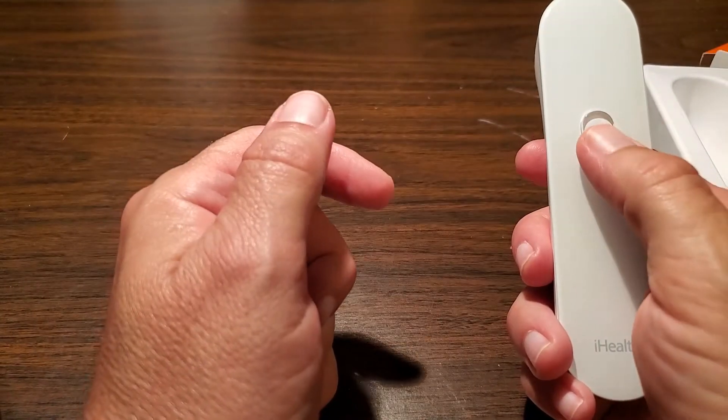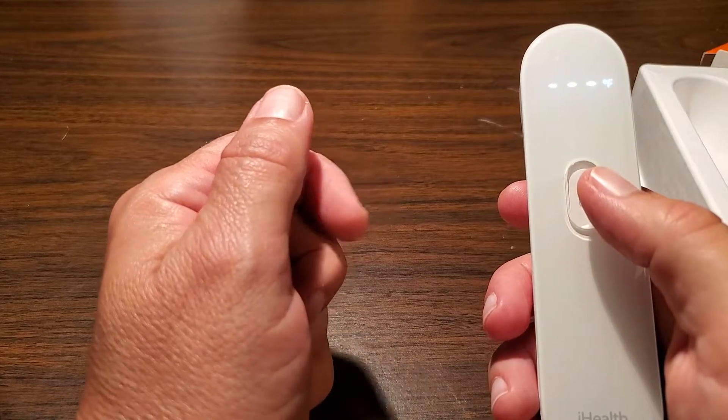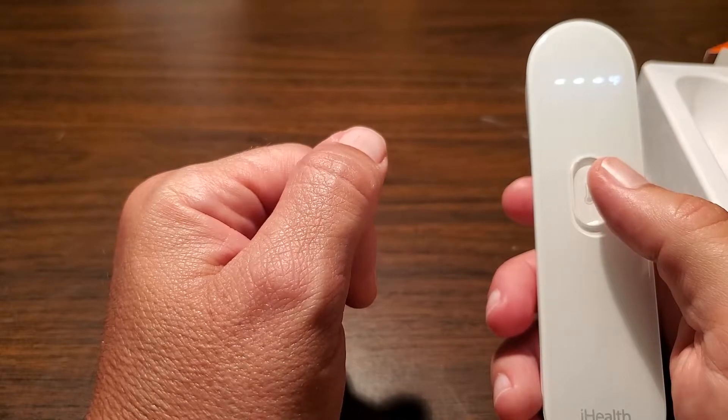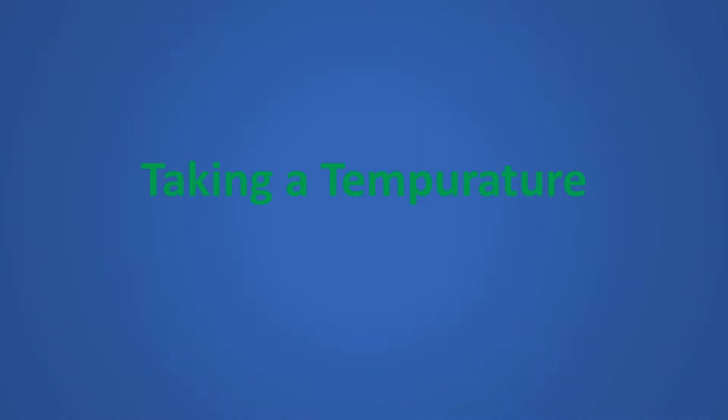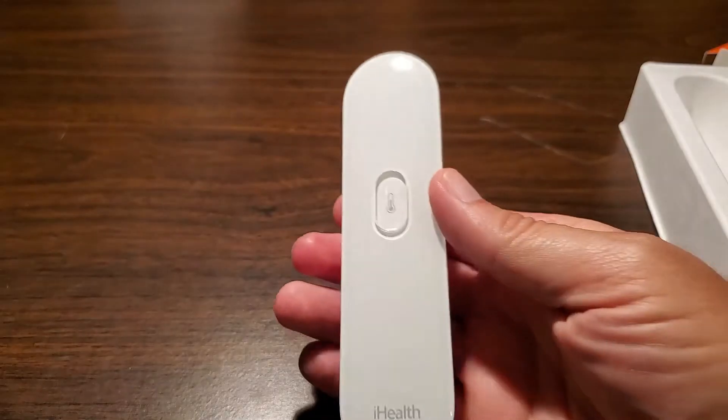The one button does everything right here. You can click on it, and since I'm out of range of anything to read, it's just showing me three dots and the Fahrenheit indicator. Let me get this stuff out of the way and I'll show you how the device works.